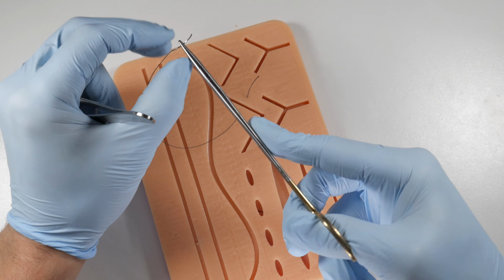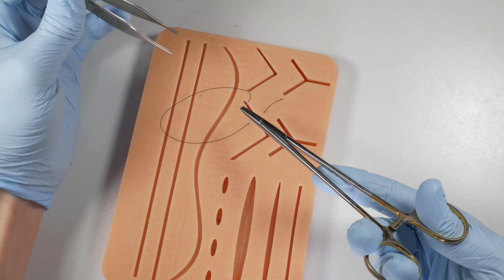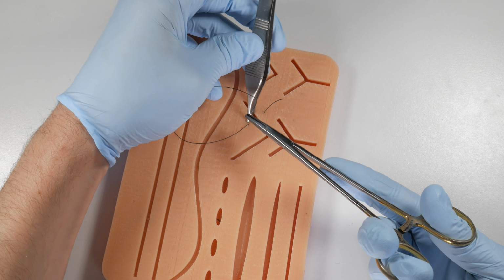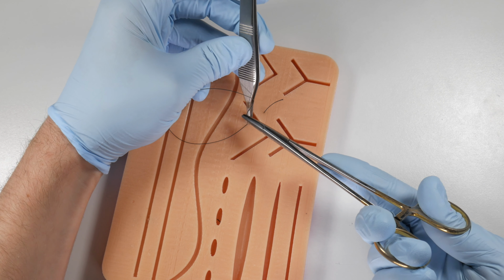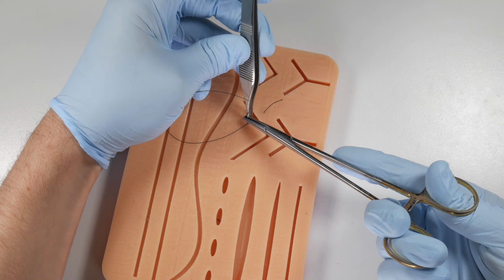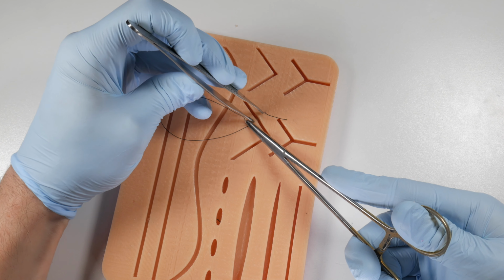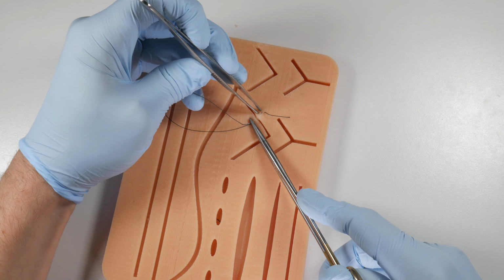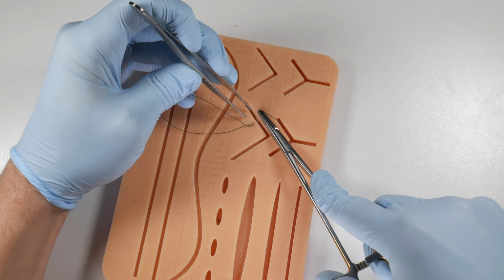We're going to regrasp that needle, and I'm going to spin this a bit just to see this a little easier. We're going to use a backhand approach this time, and we're going to pick up the opposite end of the incision here. We're going to penetrate a little tighter now to the incision line, and we're going to rotate this through. We're going to pick up the other side of the incision, and we're going to again come out a little bit closer to that incision line than where we entered in the first time.